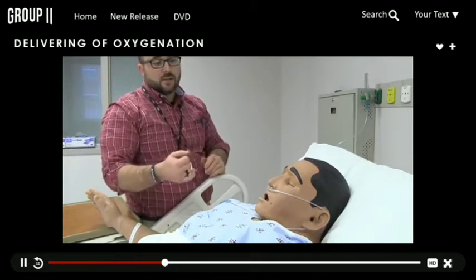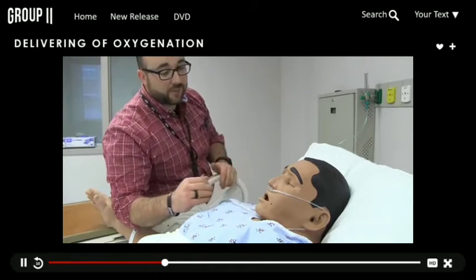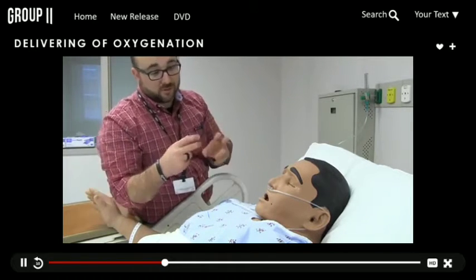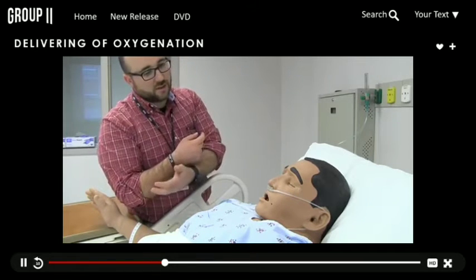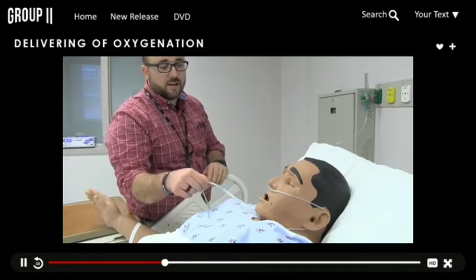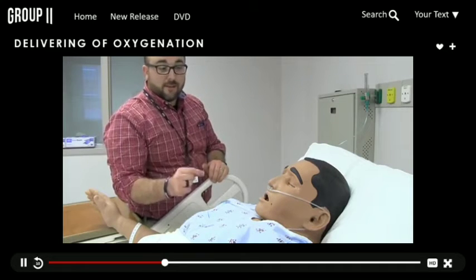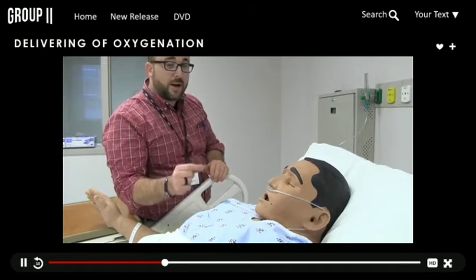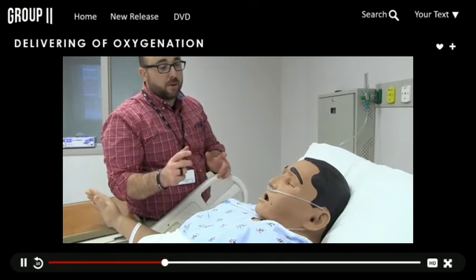So this is how a nasal cannula is run. It's going to go back into the nasal cavity, and it's going to act almost like a reservoir, so when they take their breath in, they'll pull that fraction of inspired oxygen down to their lungs, and then they exhale and take the next breath in. So this is a standard nasal cannula review, 1 to 6 liters. If the patient is on greater than 3 liters, we recommend a humidifier, or what we call a bubbler.